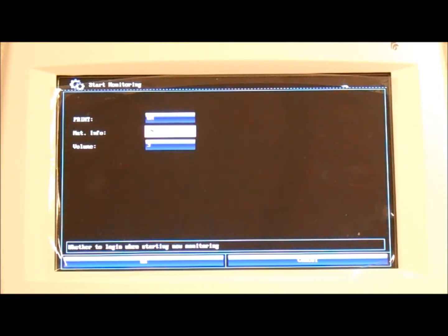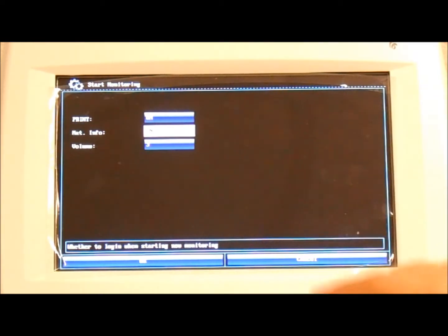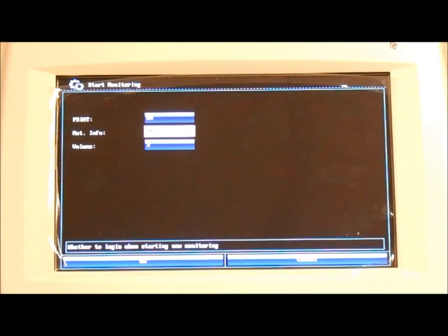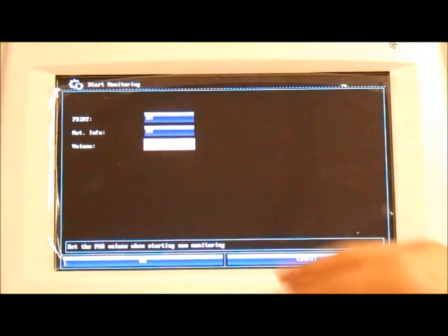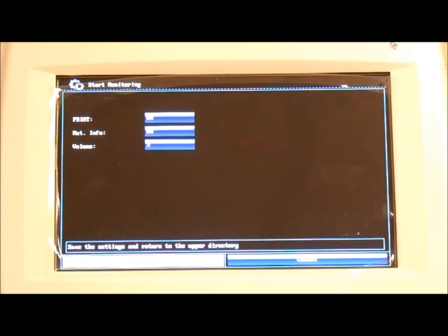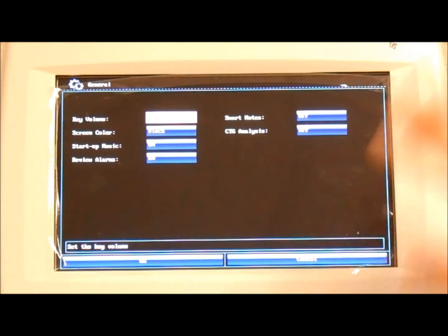Typically the most recommended setting is to have print on and maternal info on, so that the machine automatically starts printing and it'll remind you to enter the patient information. Otherwise, at the end of the day, if you have a long strip with no patient information, it may be a little bit hard to identify it. So right now we'll set print to on, maternal info to on, and volume 3. The volume is the intensity of the FHR feedback. So we press OK.